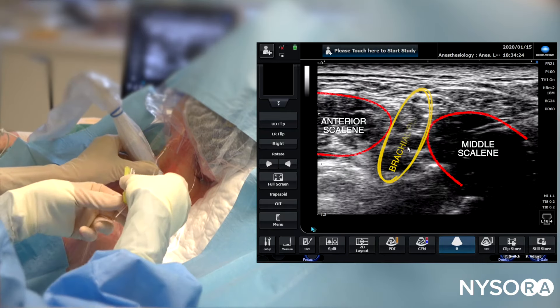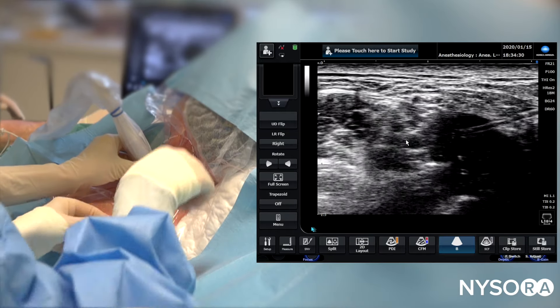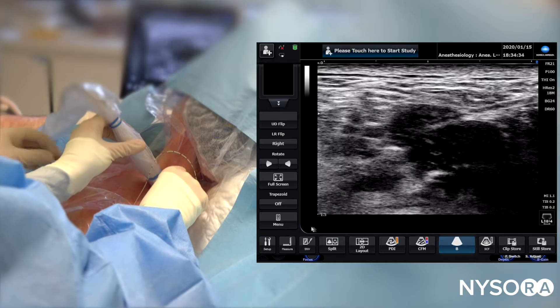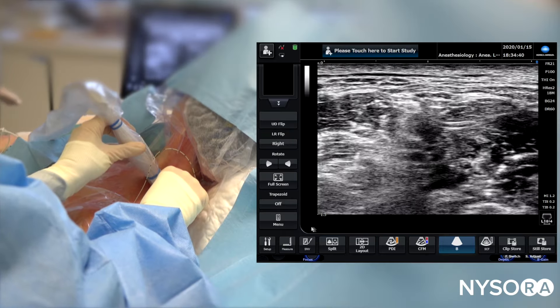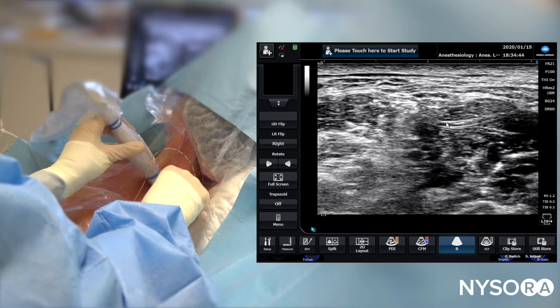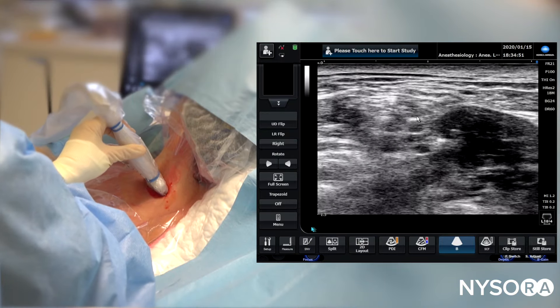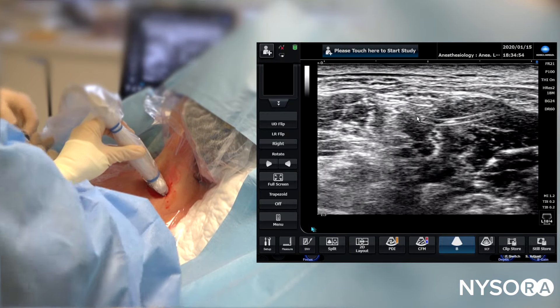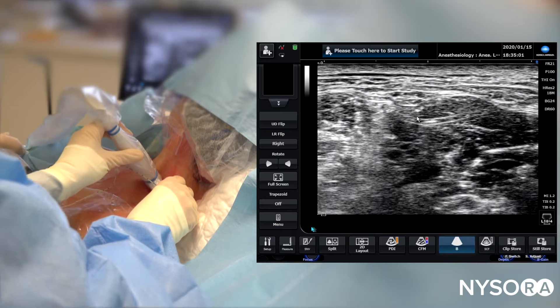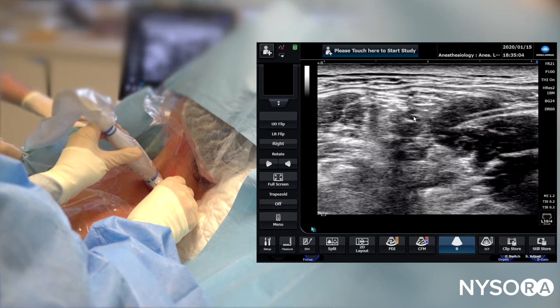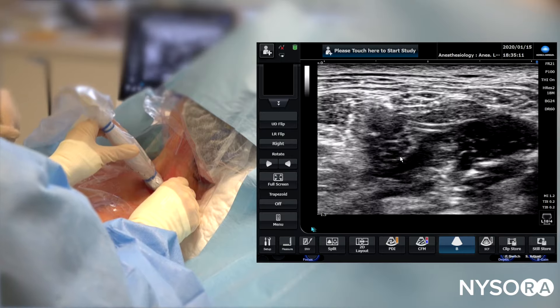That's the middle scalene muscle, anterior scalene muscle, and the brachial plexus sheath in between. Adjusting the focus point a little lower can be useful in outlining the anatomy. We're quite nicely seeing the image of the catheter and the elements of the brachial plexus. The next step in performing a catheter technique is to test the catheter position — aspiration through the catheter and an injection results in a nice displacement of the brachial plexus and local anesthetic spread inside the interscalene space.